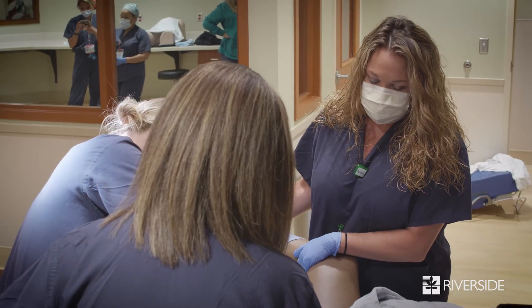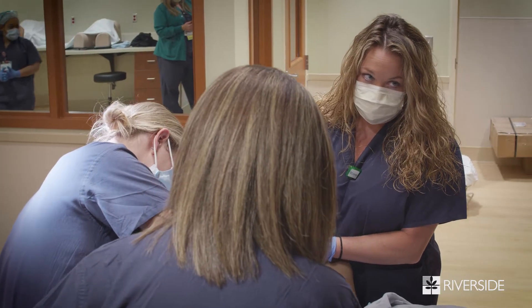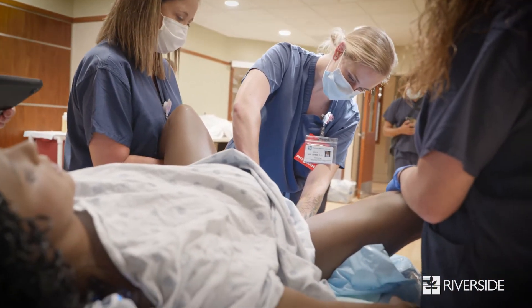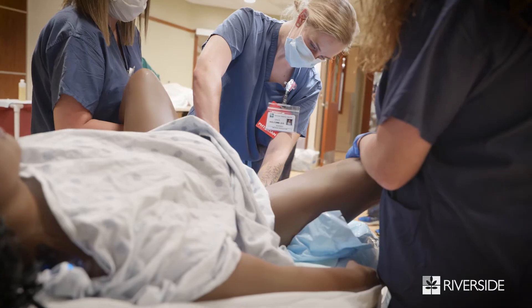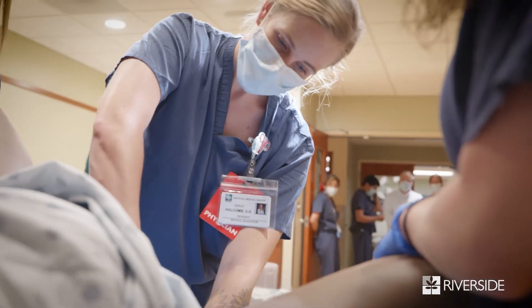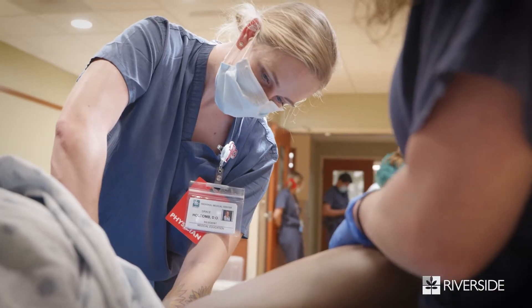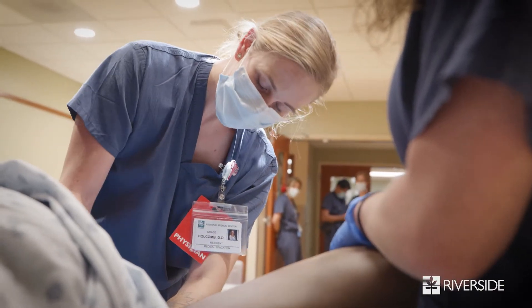She's at a plus two. Keep pushing, keep pushing. Fetal heart rate is in the 150s. Keep pushing, keep pushing, you're almost there, keep going. Here we go — a lot of pressure, pressure.